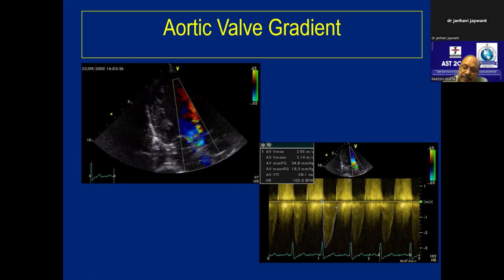But as there will be a stenotic lesion, there will be turbulence, right? Then why not take the LVOT velocity with this CW only? Suppose you take a CW over here. What do you mean by CW? Continuous wave Doppler. Continuous wave Doppler will measure velocity across the whole of this line, including along the LVOT. So it does not measure at LVOT alone. This LVOT velocity will be submerged in the aortic valve velocity.